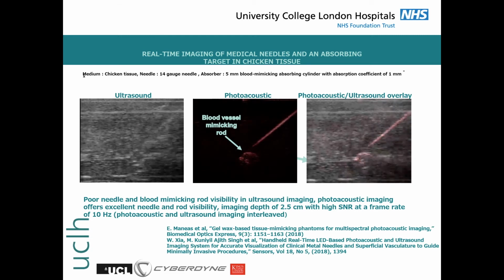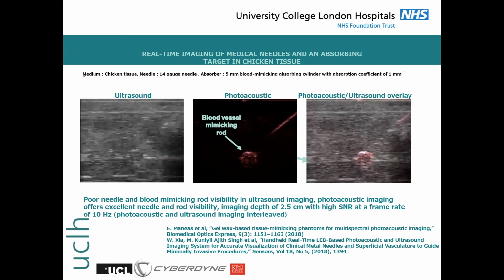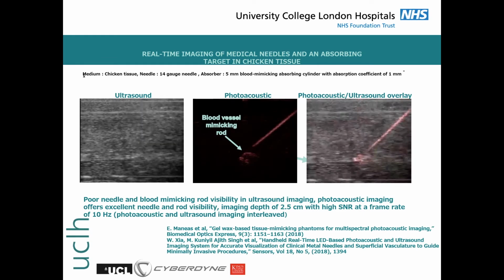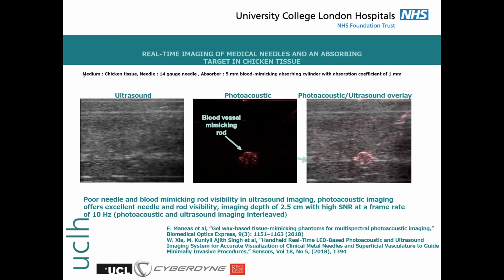Whilst one can see tissue deformation caused by the needle in the ultrasound image, the ready identification of the entirety of the linear structure of the needle, including most importantly the tip, would give greater confidence to a clinician. This shows that both the target structure to be accessed and the medical device accessing it can be seen at the same time, hence could be very valuable to improving the success rate of vascular access procedures.